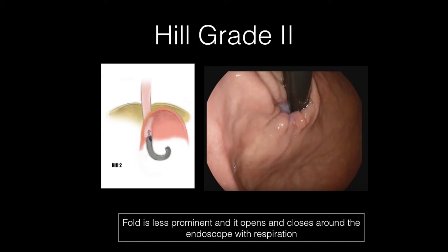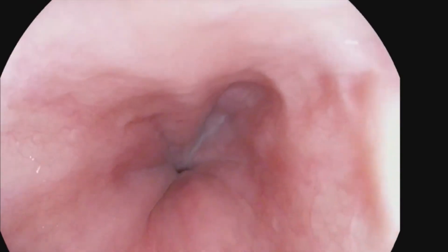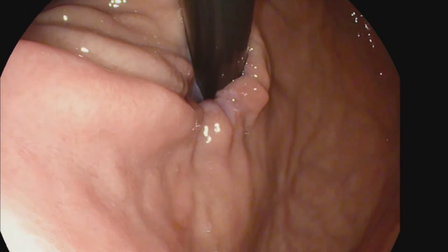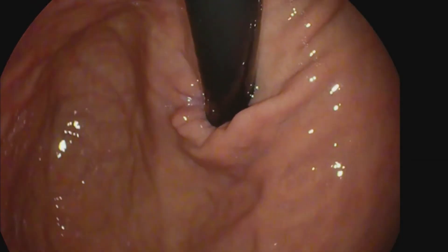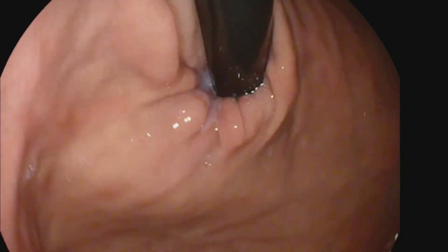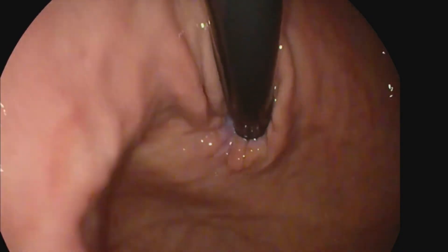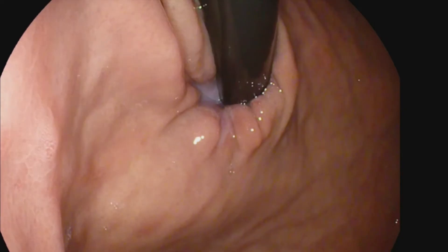With a Hill-grade 2 valve, the fold of tissue is less prominent and there are occasional periods of opening and rapid closing around the endoscope with respiration. In a Hill-grade 2, we notice the valve gaps off of the scope intermittently and often with respiration, but still grabs the scope for a significant period of time. The folded flap flattens intermittently as well.